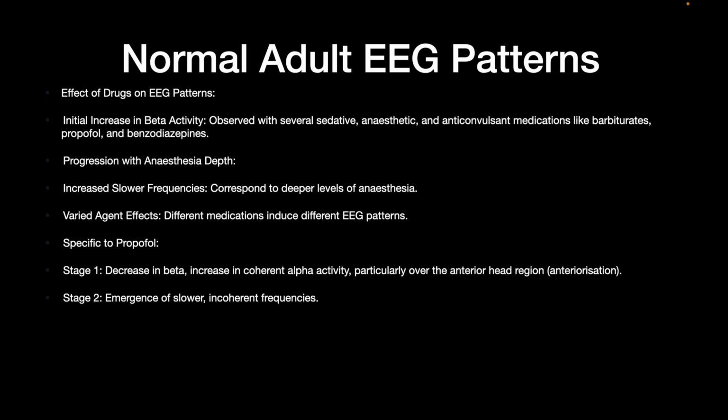Stage 2 is the emergence of slower and incoherent frequencies. Stage 3 is progression to a burst suppression. And finally, suppression of all cortical activity is called stage 4.